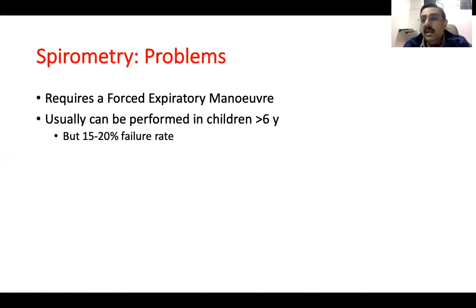So in general, in an older child, you can get a spirometry, but we do understand that it requires a forced expiratory maneuver, right? So you're able to do a spirometry in children more than 6 years of age, but again, 15 to 20% of children, even more than 6 years of age, are not able to perform a good quality spirometry.